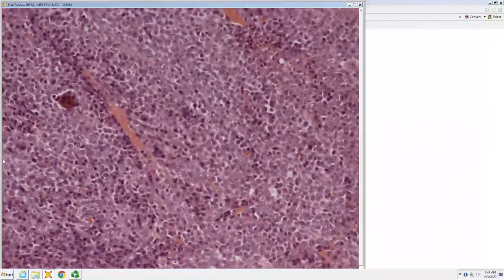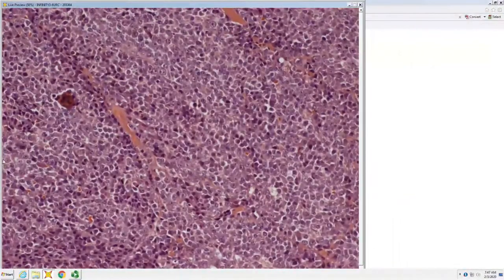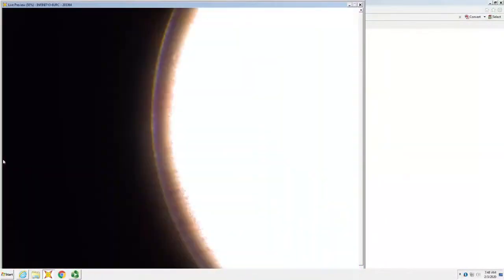Now, if they're sheets of monotypic plasma cells that are not so ugly, and look more like mature plasma cells, you're probably dealing with a marginal zone lymphoma, just overpopulated with plasma cells. Myelomas should be pretty undifferentiated, ugly-looking plasma cells. Most of what used to be classified as primary cutaneous plasmacytoma is just marginal zone lymphoma. Marginal zone lymphomas usually have plasma cells at the periphery. They're light chain restricted. That's one of the ways you can diagnose marginal zone lymphoma, but they can overpopulate.